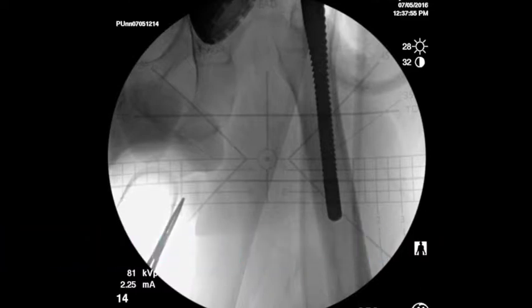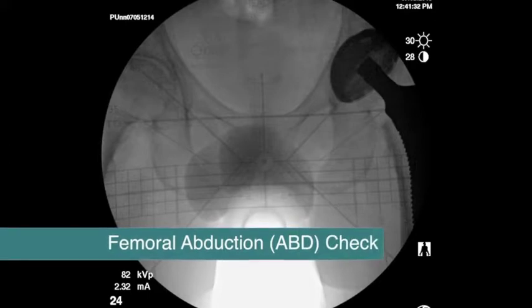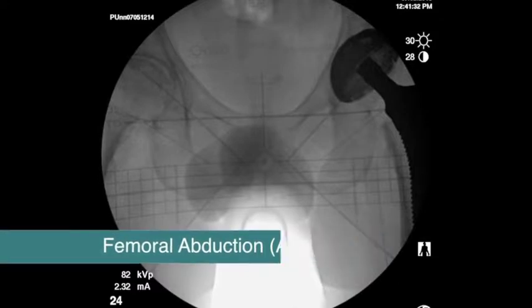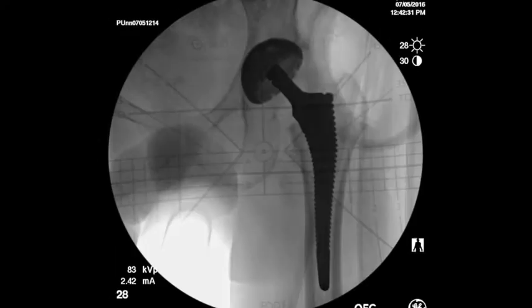Here again is that lateral of femur once I'm to the femur to make sure that my broach is going down the canal, which I'm happy with. And then we get an AP shot. This we would normally get at the broach. So that's a pretty decent grid. You know, and so my lengths right now are actually pretty close, but he just needs a lot more offset. And I want to make sure that I include the entire femoral stem.